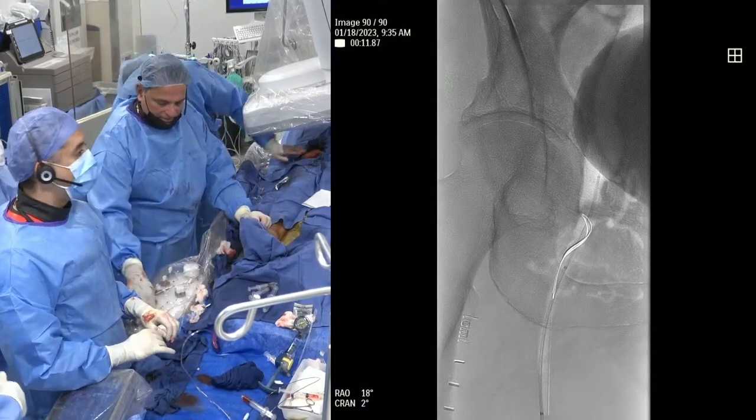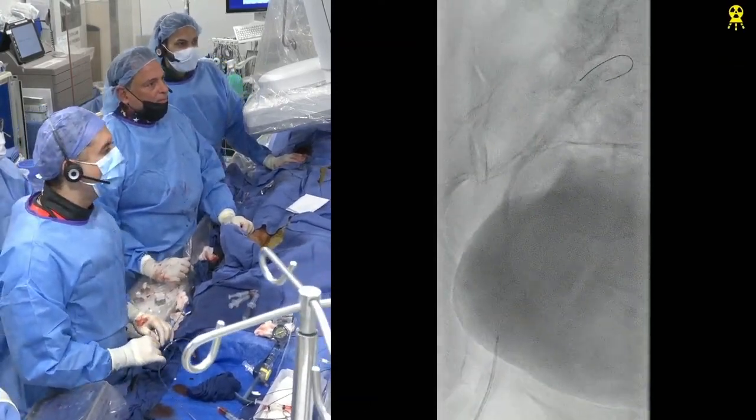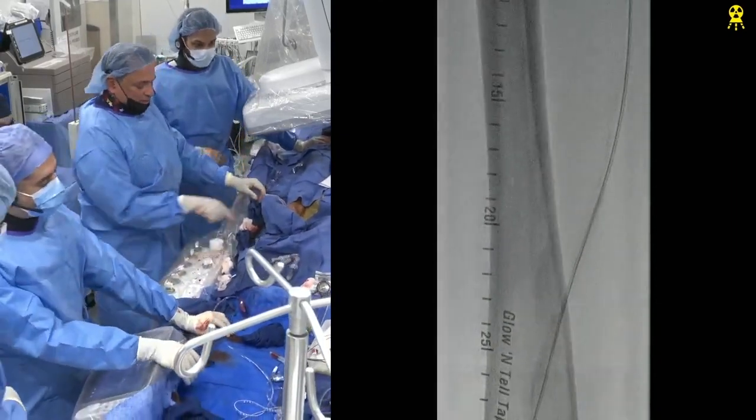Nice. Okay, so now, Ajit, are we in the graft? Yeah, we're in the graft. Looks like it. Push it up. Yep, we're in the graft. Now you're okay, that's enough. So now we're all the way here. What do you guys want to do? Let's walk this out.